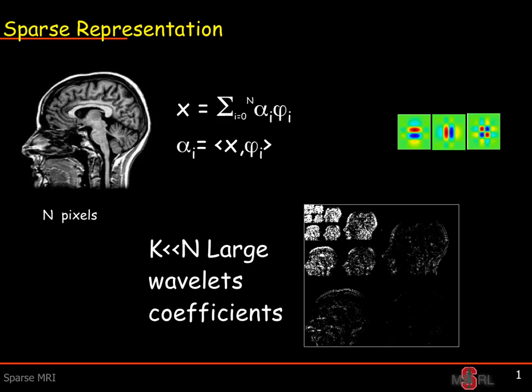This lecture is going to talk about compressed sensing MRI. Compressed sensing MRI is based on the fact that medical images are compressible. What that means, stated mathematically, is that if you transform an image into the right domain, it should have sparse coefficients. Being compressible means that it has a sparse set of coefficients in some transformed domain, where sparse means that most of the coefficients are zero.